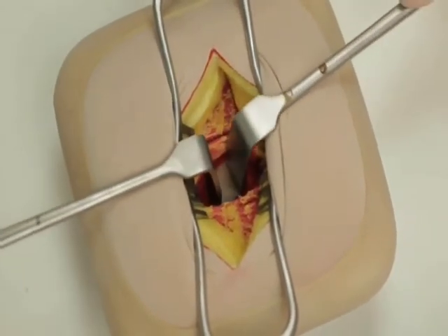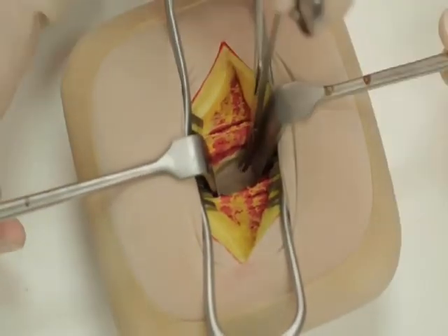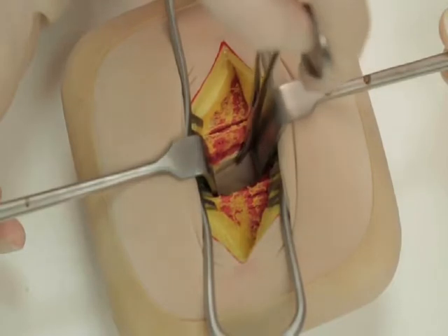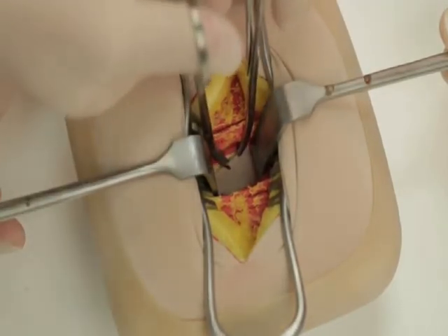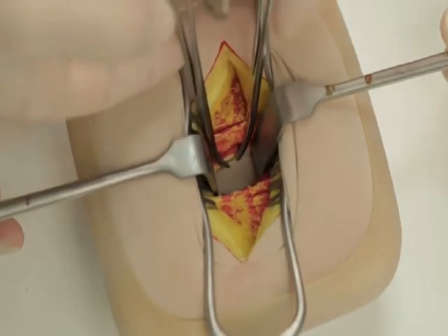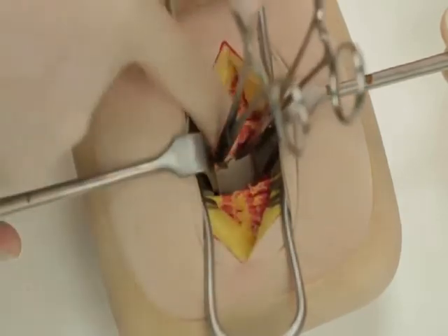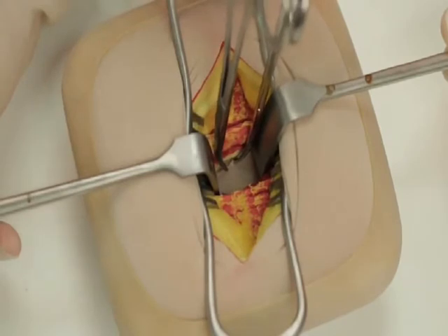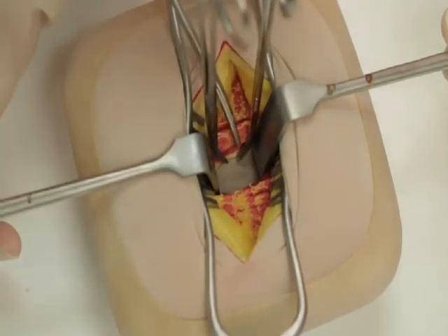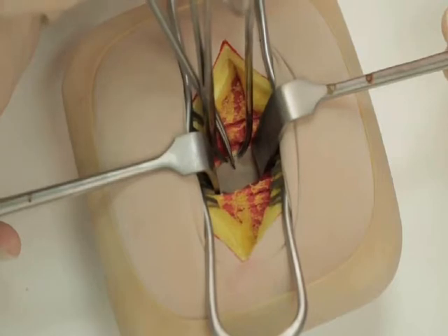Beneath this muscle, the fused transversalis fascia and peritoneum will be visible. Apply two mosquito forceps to a fold of peritoneum and ensure that only peritoneum is held by pinching the peritoneum between your fingers. Make a small incision in the peritoneum using either dissecting scissors or a knife and enlarge the hole in the line of the skin incision.